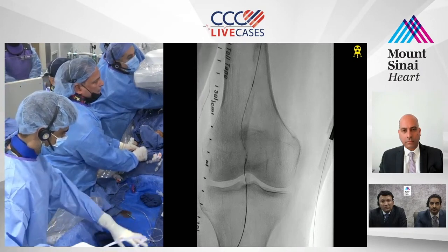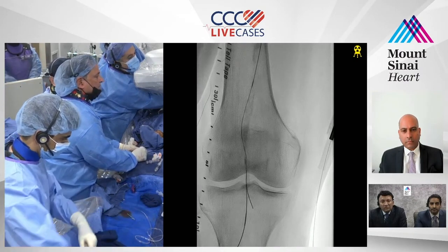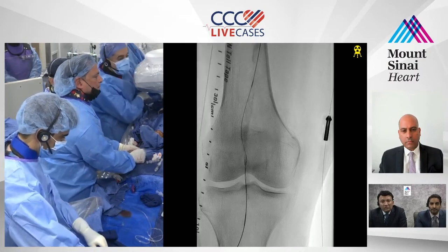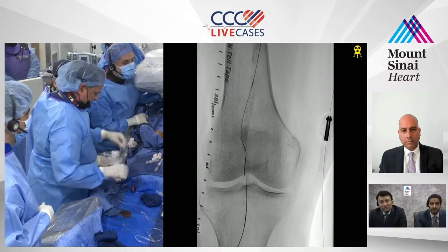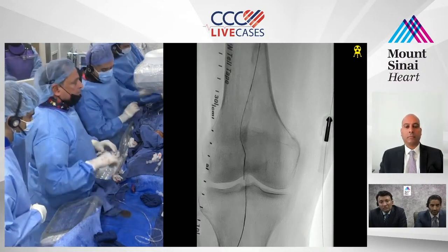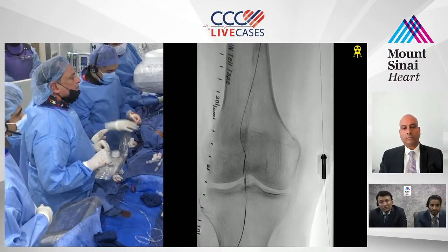No. We're definitely... that's a collateral, probably. It moves too... All right, then let's leave that there. Let me take my wire from below. Really? See over the floor. Hold on. Wait.